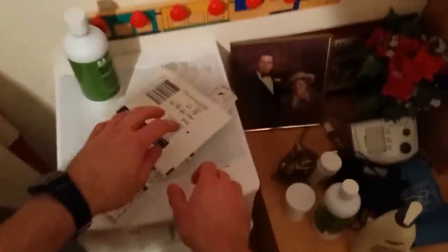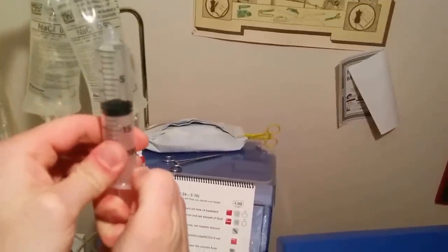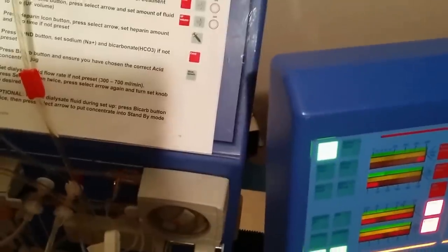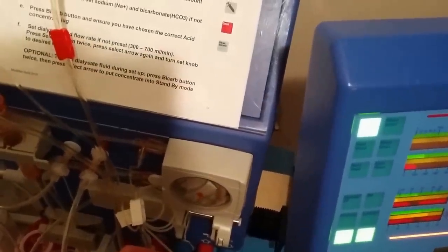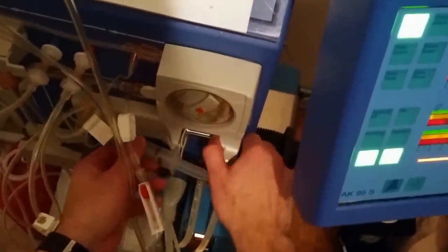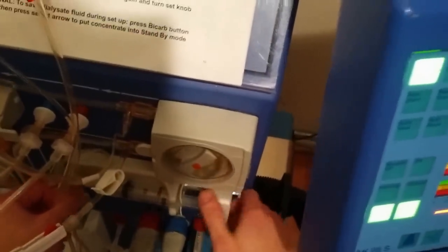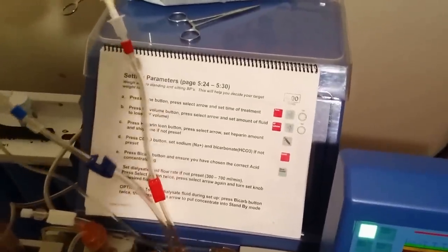Now all the tubing is set up. We grab the heparin syringe prepared earlier, give it a tap, back it off to make sure there's no air in there, then connect the syringe to the heparin input line on the tubing. There's a little worm gear that drives that mechanism. During the nocturnal dialysis treatment, heparin gets slowly added — about 0.8 milliliters every hour — just to keep the blood in the lines from coagulating or clotting, because the blood is outside the body briefly as it circulates through the dialyzer.